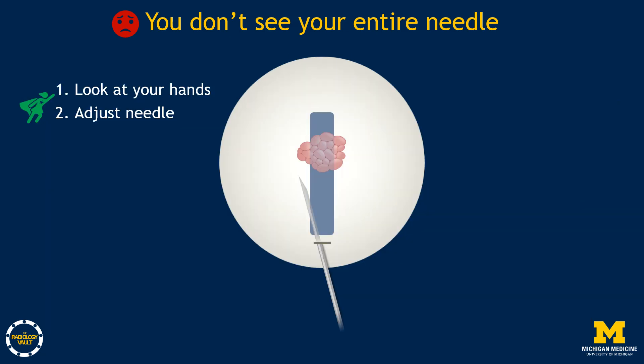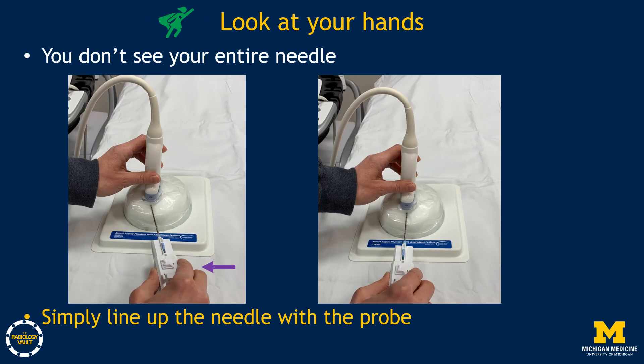So what can you do? Before taking any sample, look at your hands. If the needle isn't perfectly lined up beneath the transducer, simply adjust it. When you look at your hands, you'll see whether the needle is truly parallel with and directly below the center of the probe. Then just line up the needle with the transducer while keeping it below the probe's center.